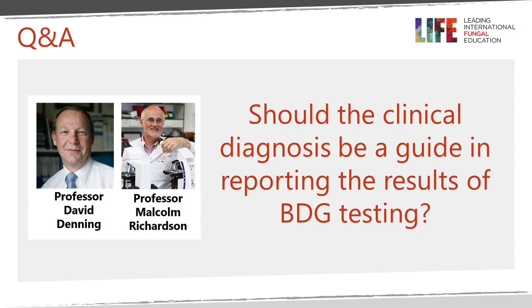Yes, and of course, our own experiences. At the moment we're doing 3 to 4 glucan Associates of Cape Cod Fungitell glucan runs per day, 4 plates, with very little clinical information accompanying the request. Of course, in an ideal world, it'd be very nice to follow up the very high values, and we've had quite a few of those, but time doesn't permit us to interrogate to find the requesting clinician and discuss the case further. That is a frustration of the setup here in Manchester.